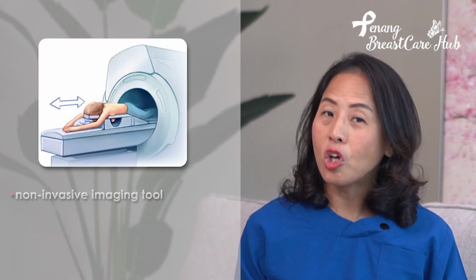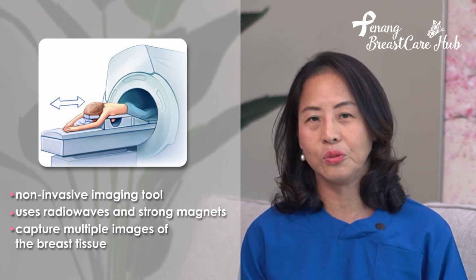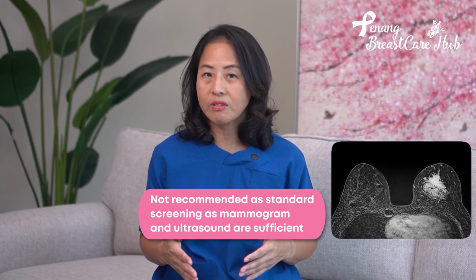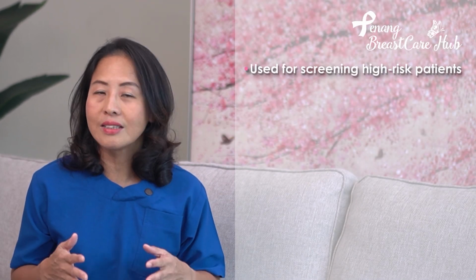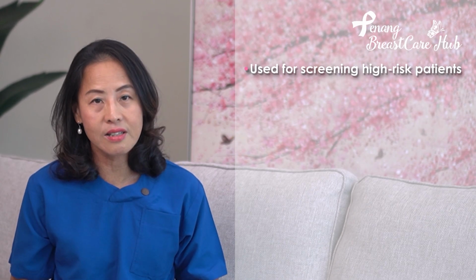Breast MRI is a non-invasive imaging tool that uses radio waves and strong magnets to capture multiple images of the breast tissue. It is not recommended as a standard breast cancer screening modality because mammogram and breast ultrasound are sufficient and overall more cost-effective. It is used for screening of breast cancer in selected high-risk patients, like BRCA gene patients or those with hereditary breast cancer.